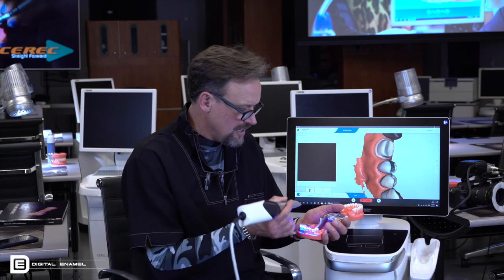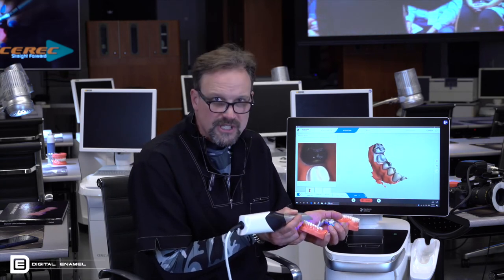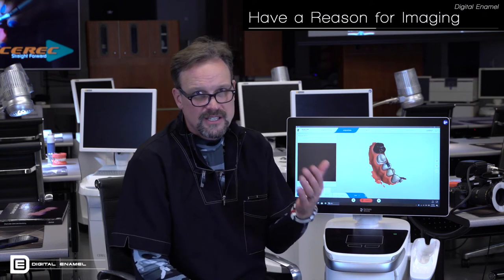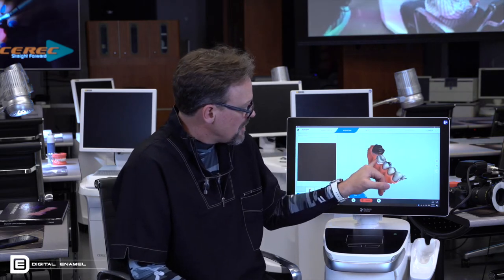So you don't have to take your camera and keep showing it the mesial of 31, again and again, megabytes, megabytes, megabytes. The file's just getting larger and larger and larger. So have a reason for imaging. You need to image to what you're going to mill to the best, so you don't have to keep going on and on and on.